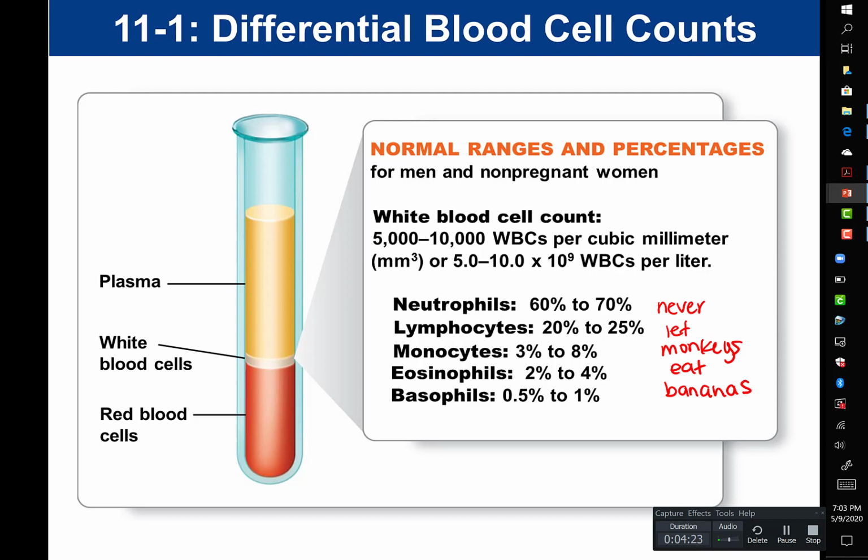And so what you're going to see when we look at these blood smears is that in any given field of view, maybe you're going to see 2 or so white blood cells. If you're looking for a basophil, you have to see at least 100 white blood cells before it's likely that you're going to find a basophil, because they only make up 1% or 0.5%.